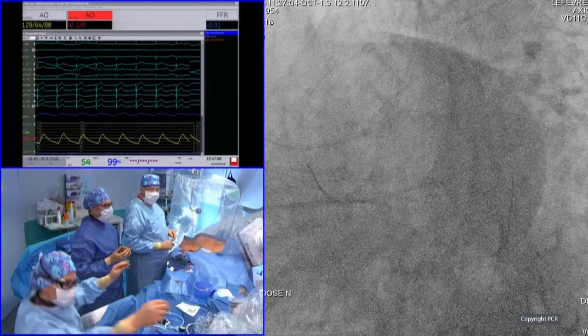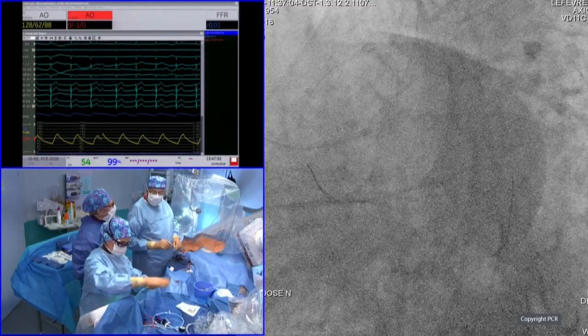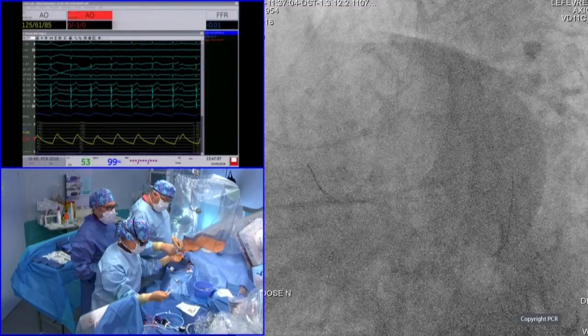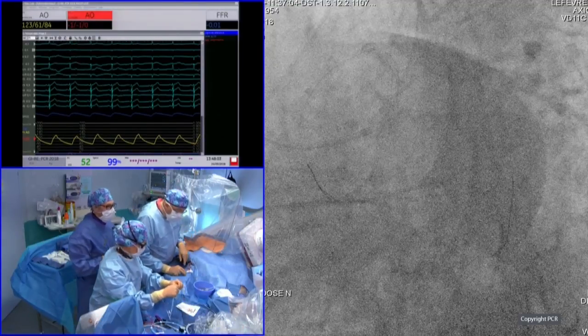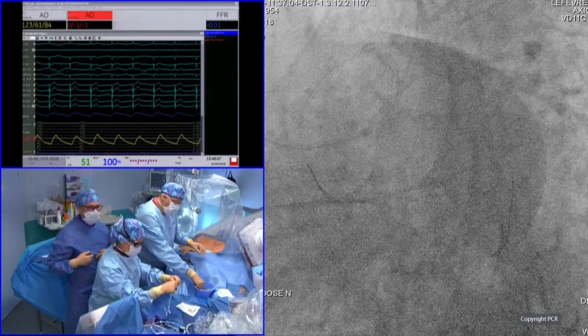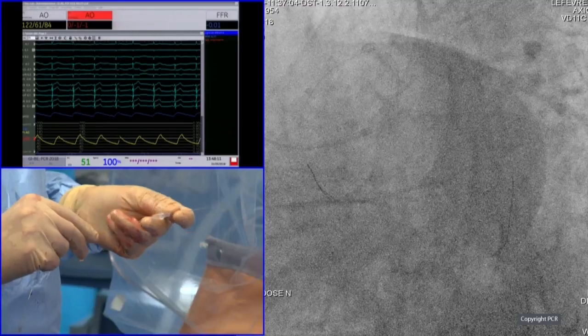There is no intimal proliferation in this stent, so we prefer to leave it like that because it was done many years ago and we have a very nice lumen inside. That's why we will not touch the junction between the new stent and the old one. But of course, if we had intimal proliferation by OFDI, it's a different story, and probably we'll have to do something.